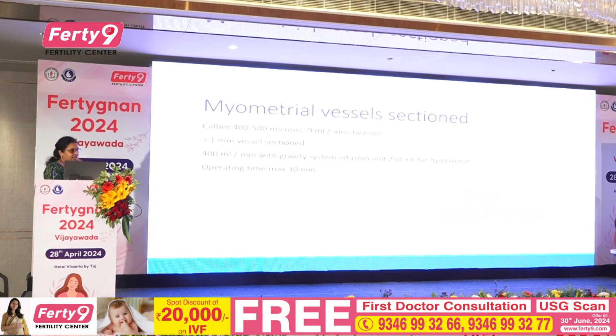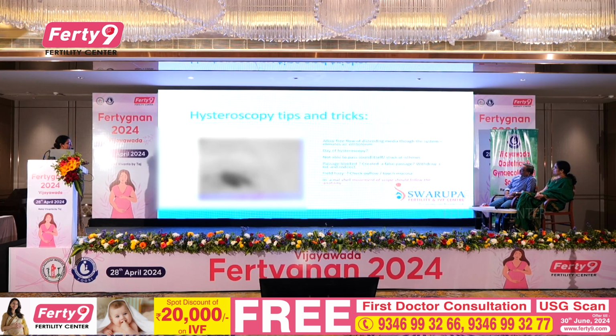Suppose you're a beginner and you're unable to do your surgery, suppose a septal resection or a submucosal fibroid resection, it's always better to counsel our patients that this surgery might be done on a second look also. In that way, we'll be very safe and we can restrict to this time limit so that we will not have this fluid overload. So, here are some small tips and tricks on how to go about hysteroscopy.